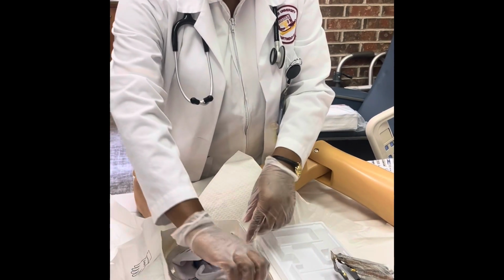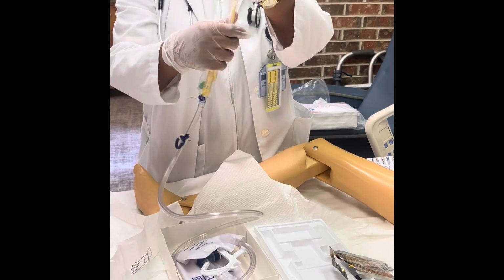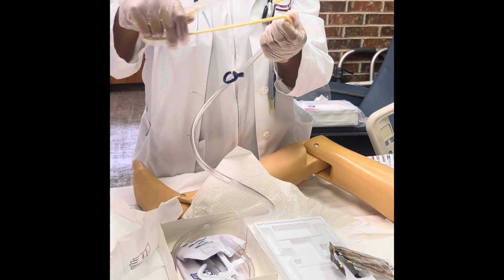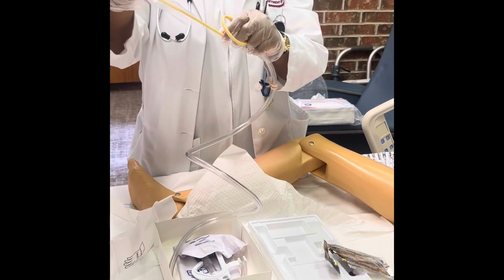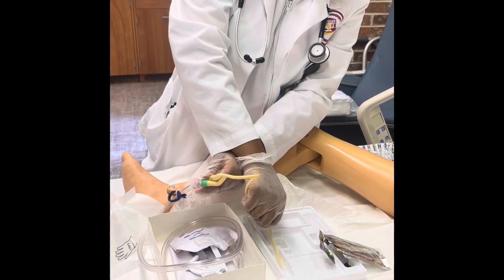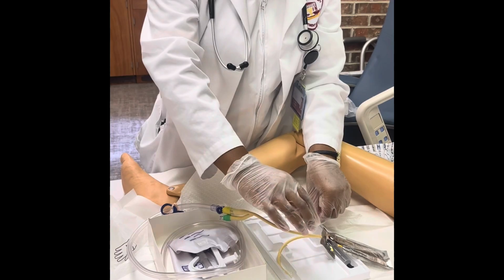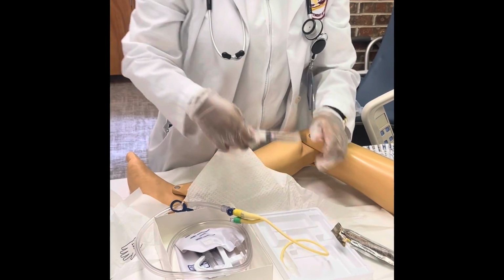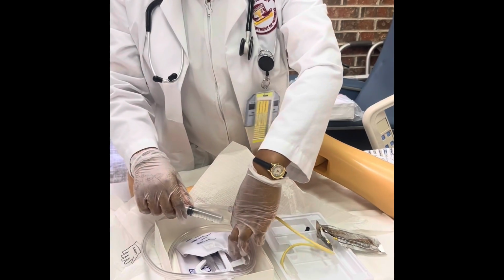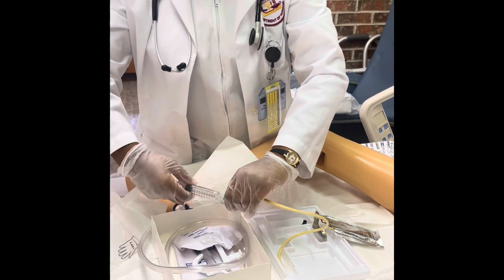And then I can take the catheter out of the tubing. Do it carefully. You don't want to fling around because you don't want to get lube everywhere and get contaminated. Trash. Rub it around in the lube. Leave it there to sit. And then I'm going to attach my syringe to the catheter because this is what I'm going to be using to inflate the balloon to get the catheter to stay inside the patient.